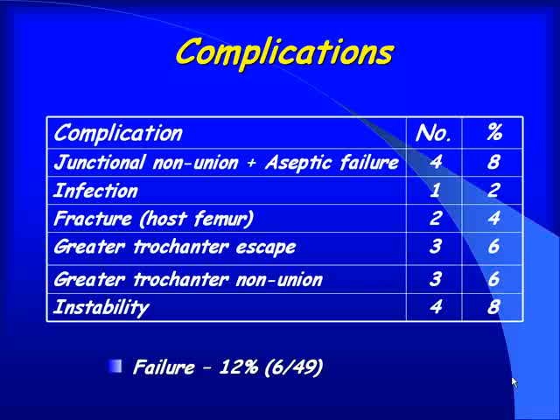In 3 cases, a reattachment of the greater trochanter was performed for trochanteric escape. In one case, after a postoperative host step cut fracture, the patient underwent open reduction and internal fixation using tibial strut allograft. One case with resorption of the allograft underwent augmentation with tibial strut allograft, and one patient underwent exchange of the acetabular liner and femoral head for recurrent dislocations.